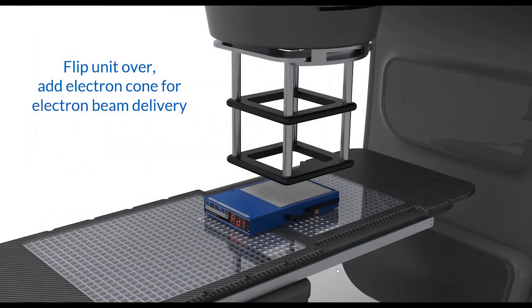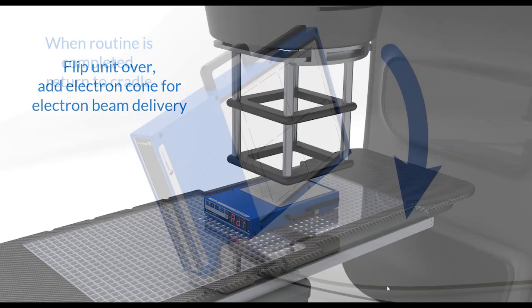Then, assuming everything is good, you would simply walk back into the vault, and since you need to put your electron cone in anyway for electrons, you simply do that. Flip the device over. You know that the distance is correct again, and you simply need to realign to the light field, the 20 by 20 light field. There's a button on the front that you press to say mode, and you would switch to electrons, and the display inverts so that you know that you're looking at it correctly. You've done the alignment, and you're all ready to deliver your electron beams.